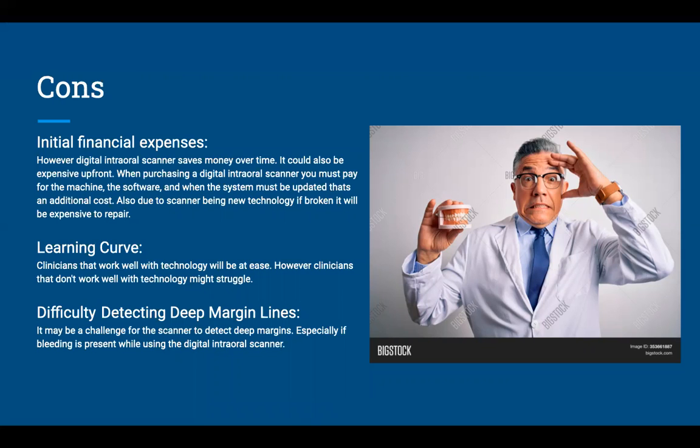But clinicians of an older generation are more comfortable and have a higher expertise level with the traditional conventional impression route, so there may be some pushback with staff. And lastly, there may be difficulty in detecting deep marginal lines.